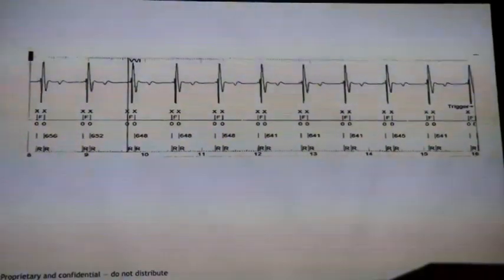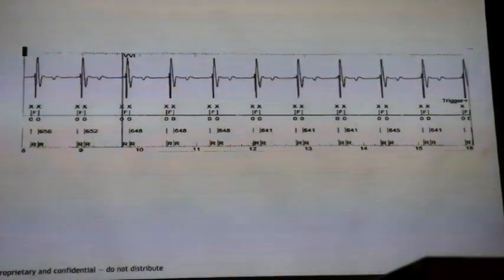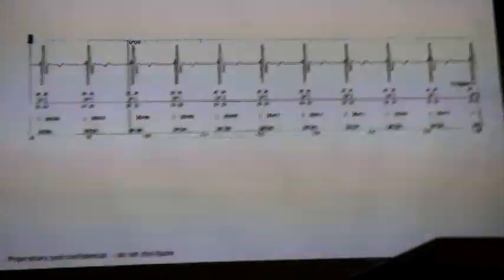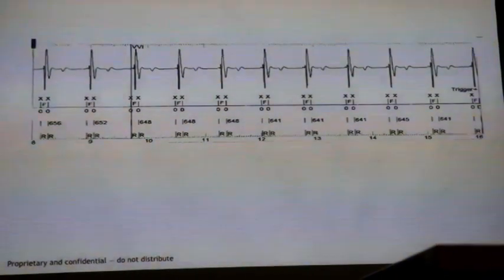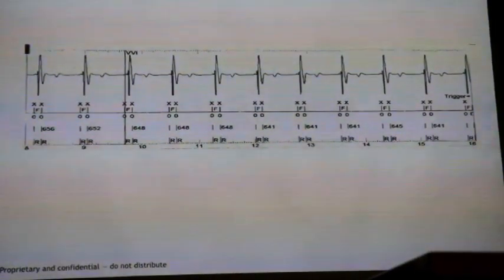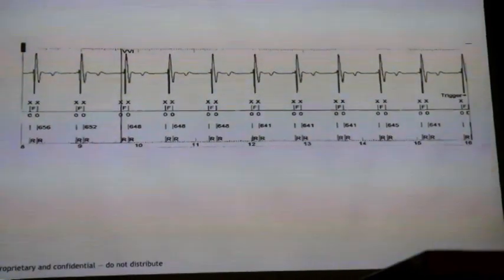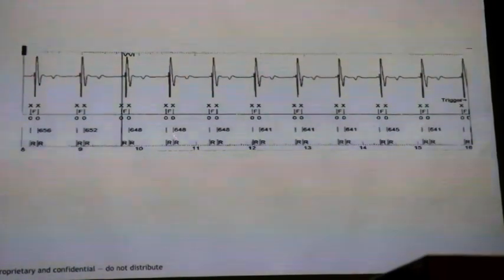And how big is the R-wave measurement here? The R-wave here was big actually. It was like a 12 millivolt R-wave. Because usually when you have a problem with sensitivity, it's usually a smaller wave, especially T-wave oversensing. T-wave oversensing pretty much is always tiny little R-waves. You have to move your lead somewhere. That's why we're asking for signals greater than 5, 6 ish at implant.